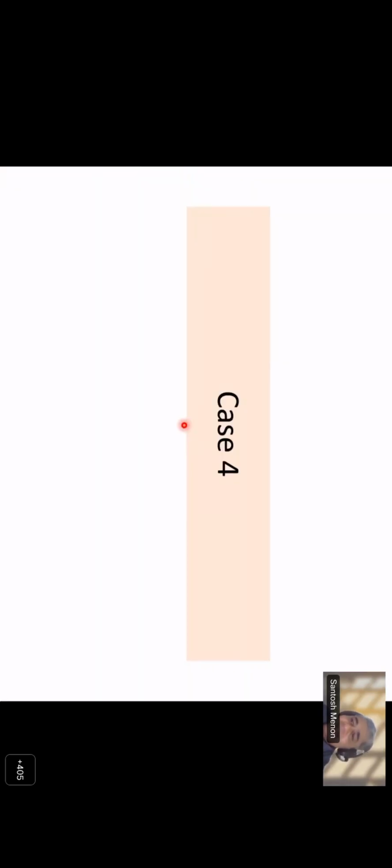Can I just make one point? Yes, please. One pitfall to be aware of is a variant of prostate cancer called P63 positive prostate cancer, which commonly has an atrophic pattern.